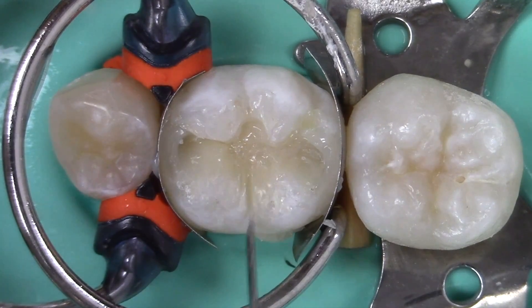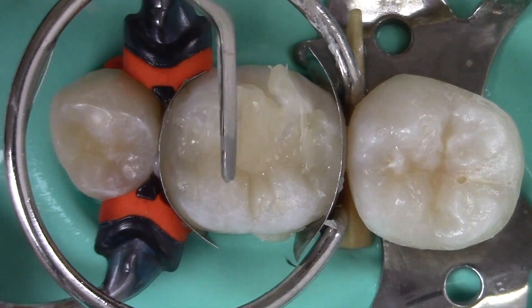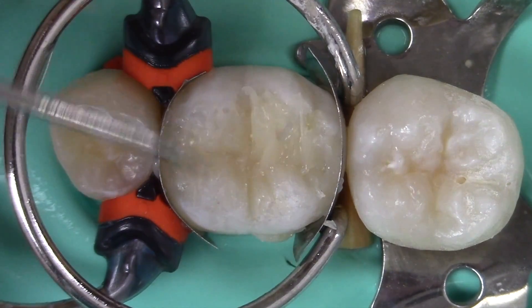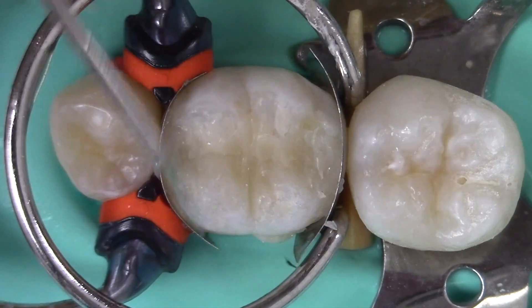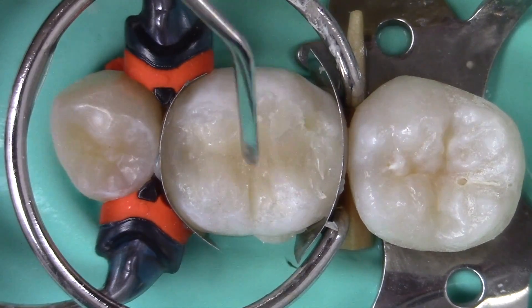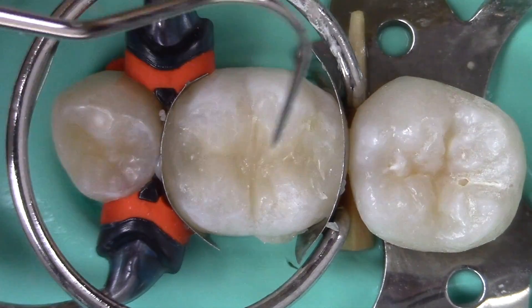Grooves may be formed with the side of the carver. This process is then repeated for the opposing cusp. Note that the material is constantly being condensed against the side of the preparation. Secondary anatomy may be produced with an explorer.